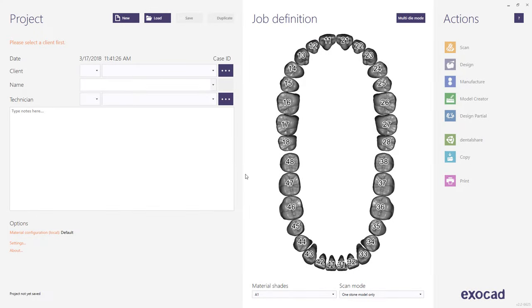This video tutorial from ExoCAD shows how to design a removable partial denture with visualization teeth, metal backings, and a metal dummy using ExoCAD's Partial CAD module.